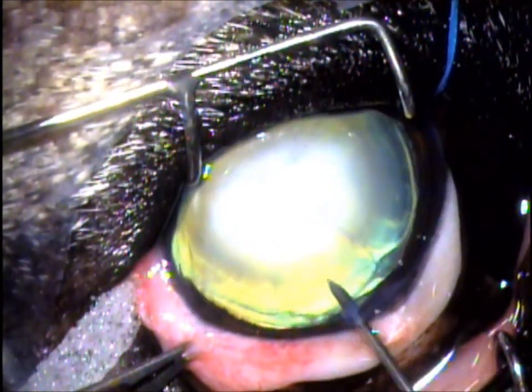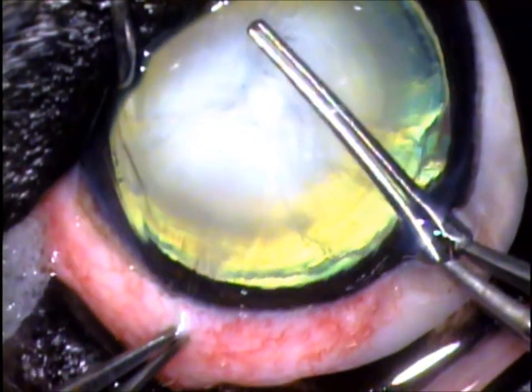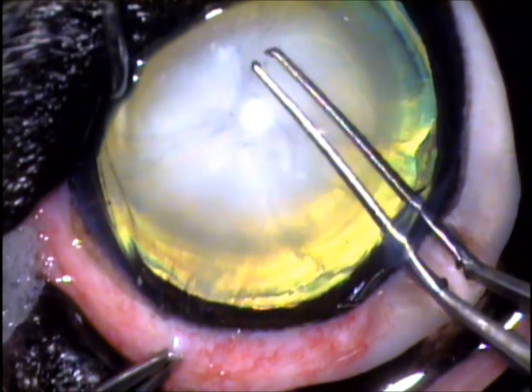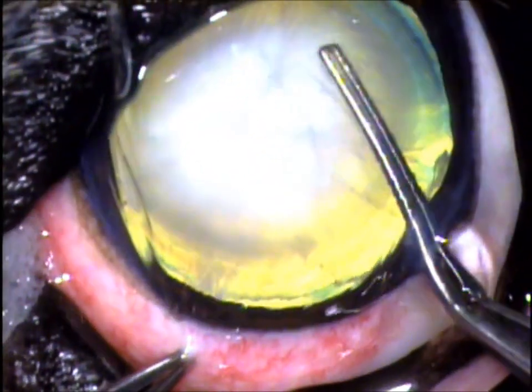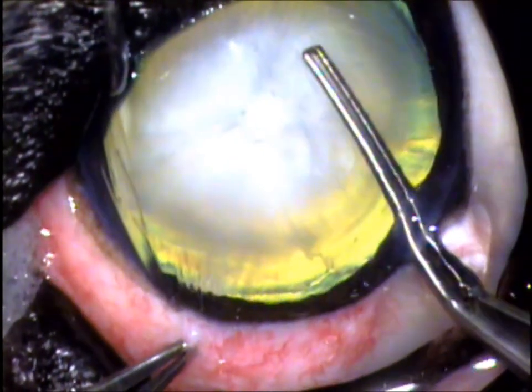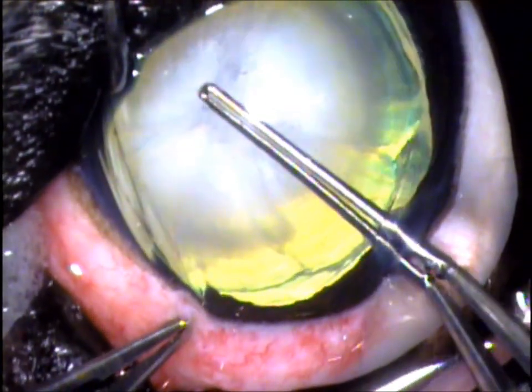We then do in-the-bag cataract surgery. I need to tear a hole in the front of the capsule to get at the lens, while leaving the rest of the lens capsule intact so that we can put a false lens in later on. This is the capsulorhexis, and you're seeing me tearing what should be a perfectly circular hole in the lens capsule, which will minimize trauma to the eye during the rest of surgery.